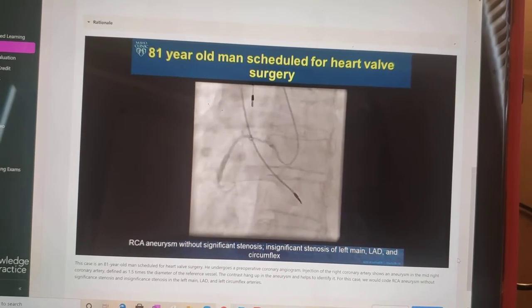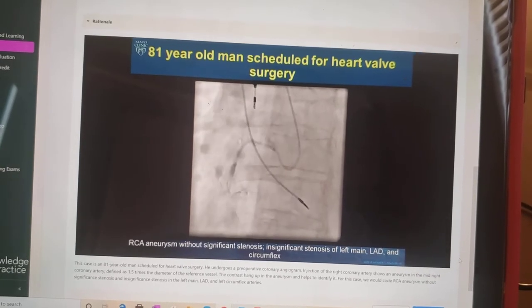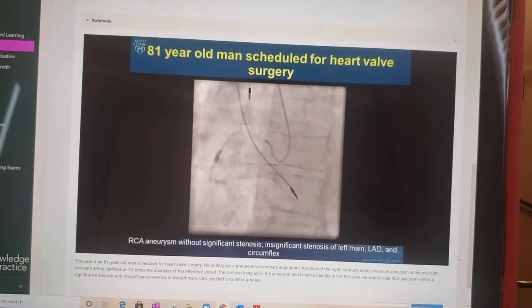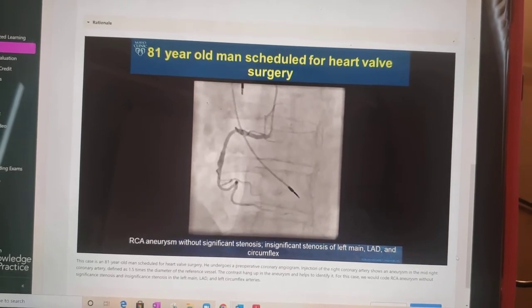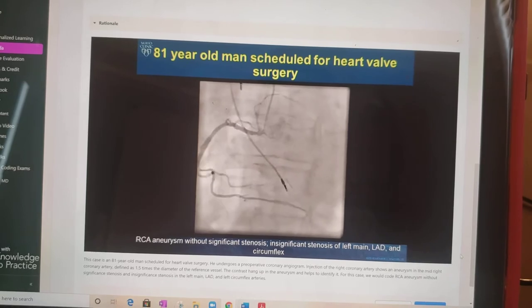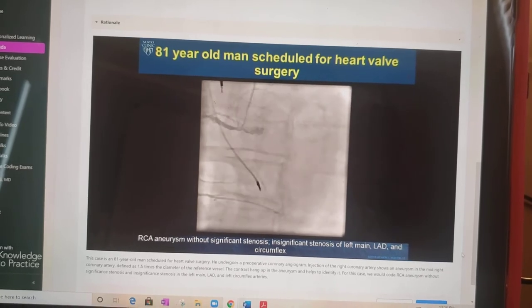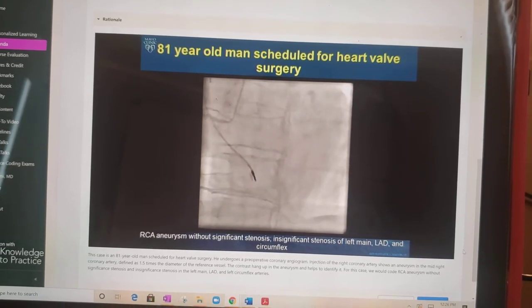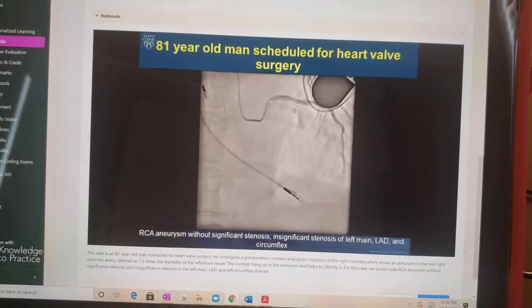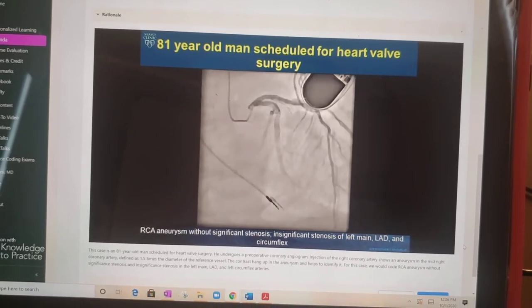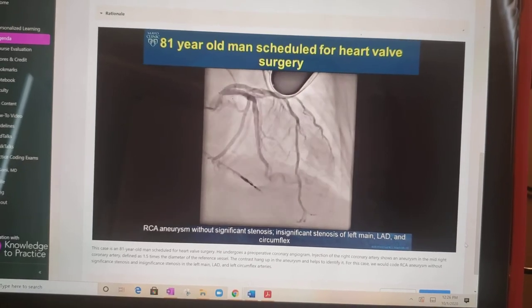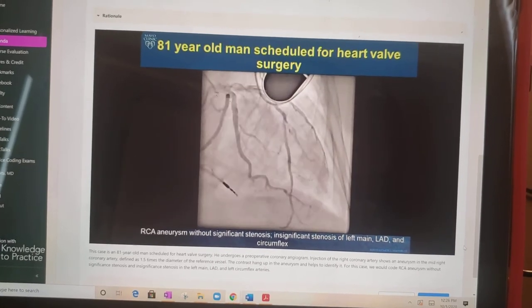On injection of the right coronary artery, we notice an aneurysm present in the mid-right coronary artery. The definition of an aneurysm is 1.5 times the diameter of the reference vessel. There is also a little bit of contrast hangup in the aneurysm that helps to identify it.